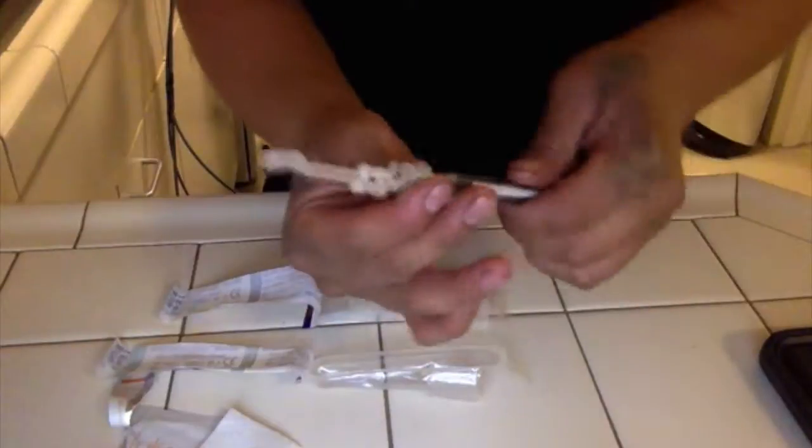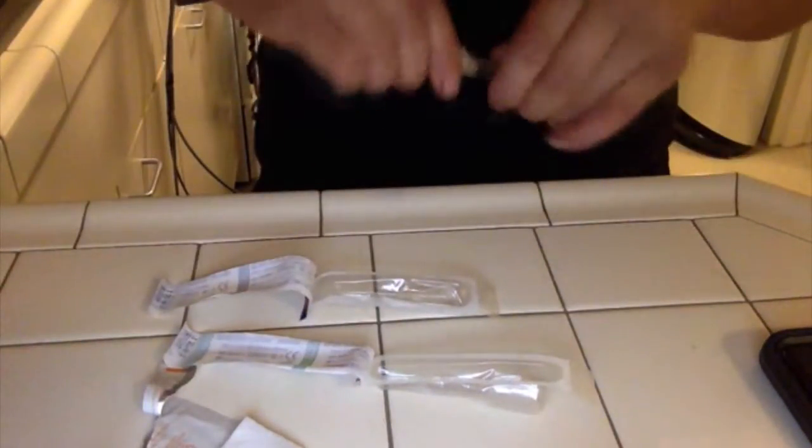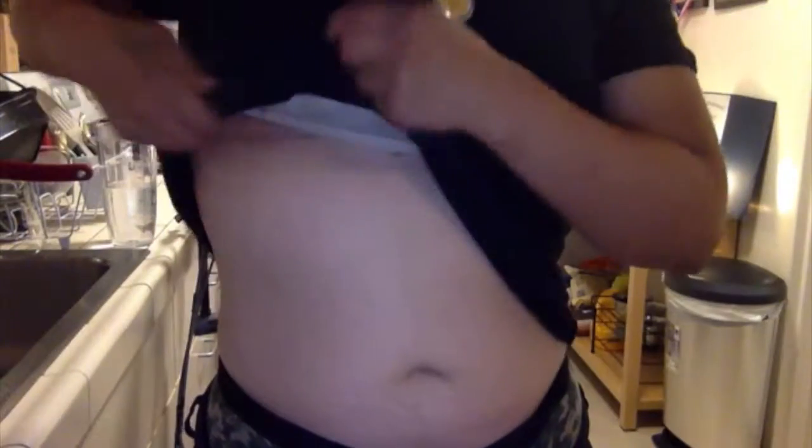I'm gonna take this and pop it like that so I'm not covering the needle, and just twist it off. Put it in the box here, screw this on, take that off, and then sterilize.